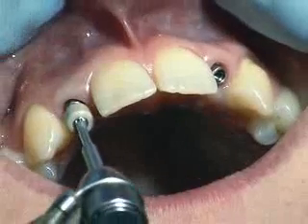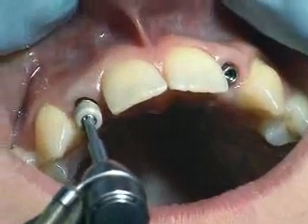While the superstructure is being fabricated in the dental laboratory, the implant is sealed with a protective cap and a temporary restoration is inserted.